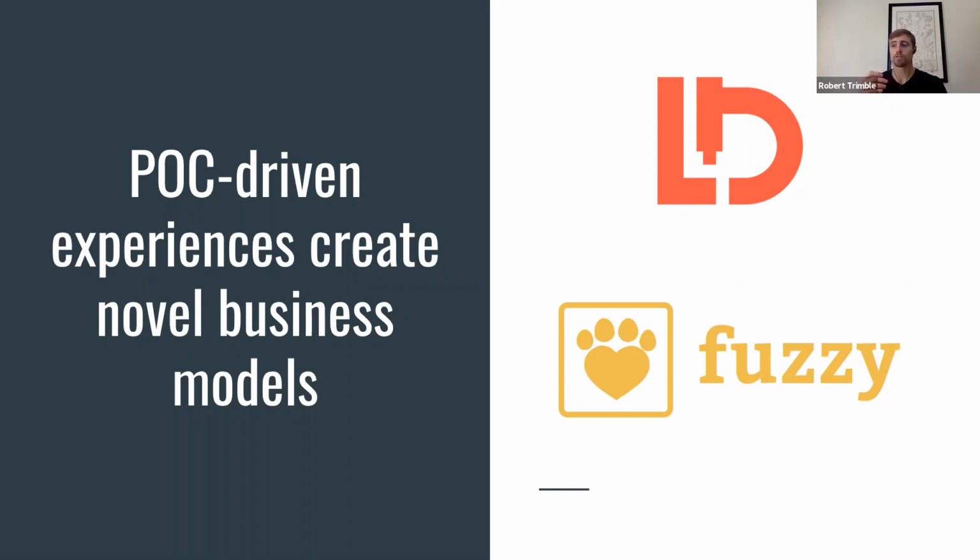So when this company was doing house calls, it first offered clients a free first visit to try us out, to try out the company before they ever even signed up for it. And at that visit, the healthcare providers would include a free heartworm test. We would draw a drop of blood from the dog, and we would do the heartworm test right then and there. The results were done by the end of the appointment.